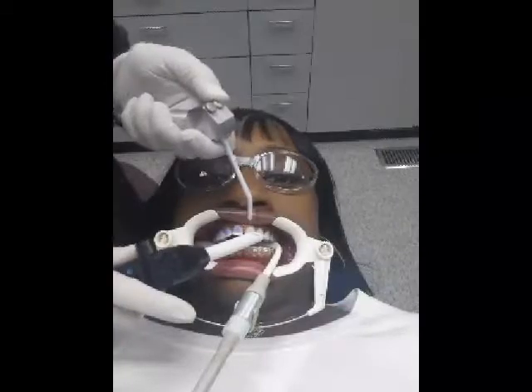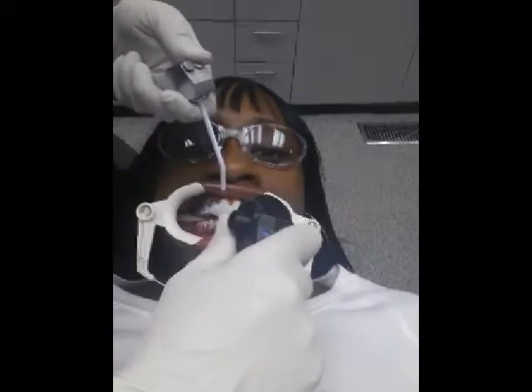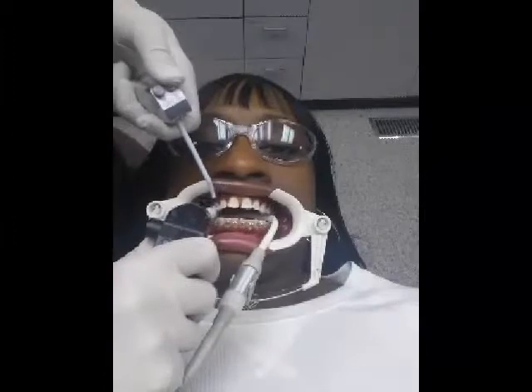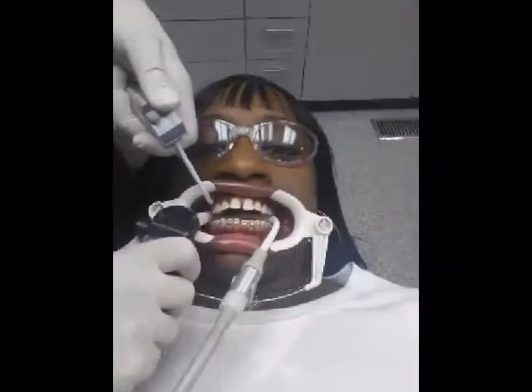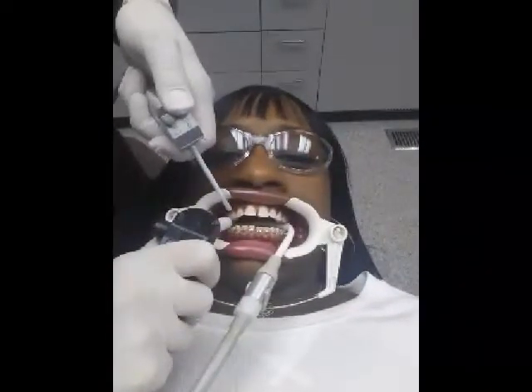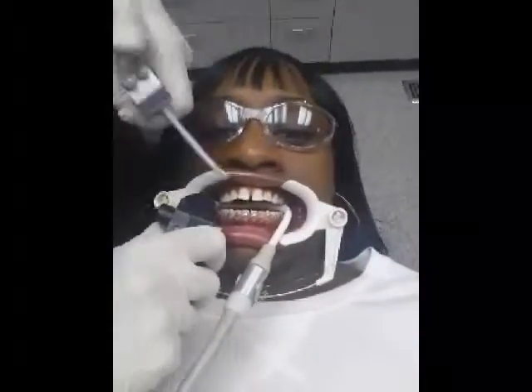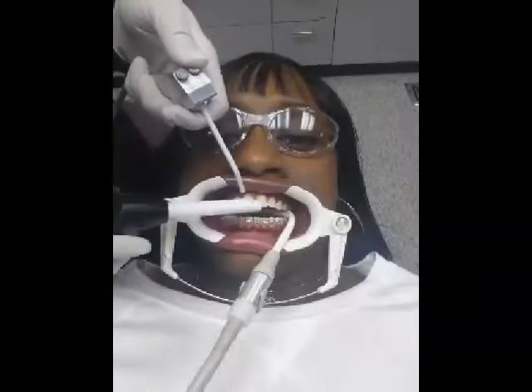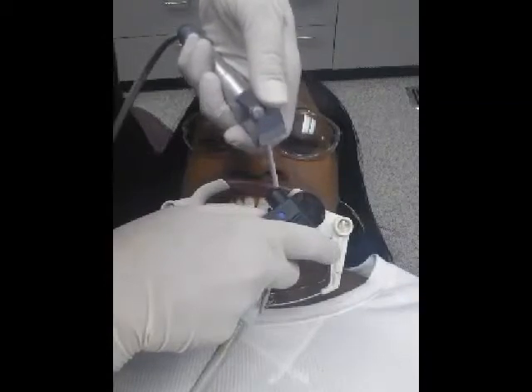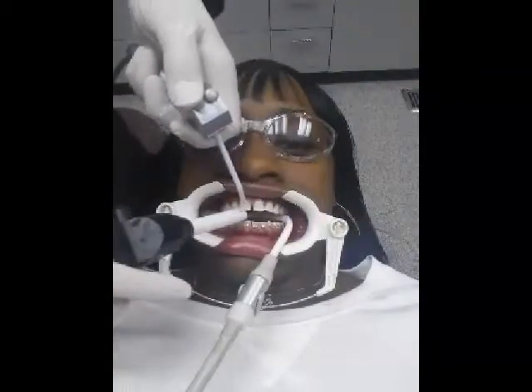Now this is where she is rinsing off the blue stuff, the cleaner, and she rinses off each tooth thoroughly so that all of the blue stuff is gone. And then she dries each tooth with that tooth dryer. She air dries them individually so that everything will stick properly.